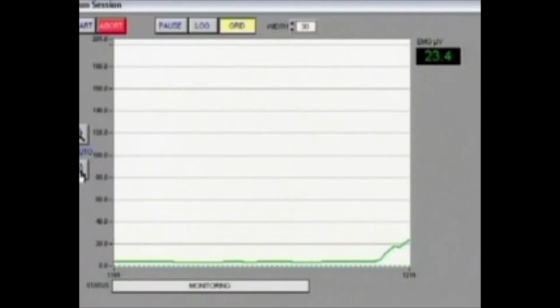Belinda, let's try it one more time. So just clench as hard as you can. We'll just see what you do this time. Just as hard as you can. Okay, this time was about 27. Okay, you're getting a bit tired there. Okay, so again, this demonstrates powerfully the suppression effect of the MCI, and it goes a long way to explaining the superior results that we see with anterior splints like the MCI in suppressing clenching and getting rid of symptoms.